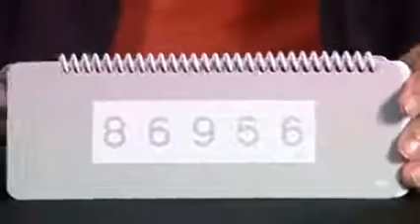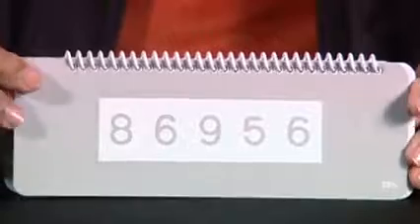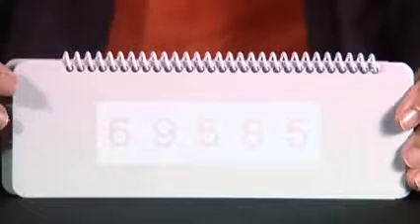When using this test it is important that you keep the test vertical. Because as you can see, if I tilt it backwards it becomes much easier. The idea is to keep it constantly vertical.